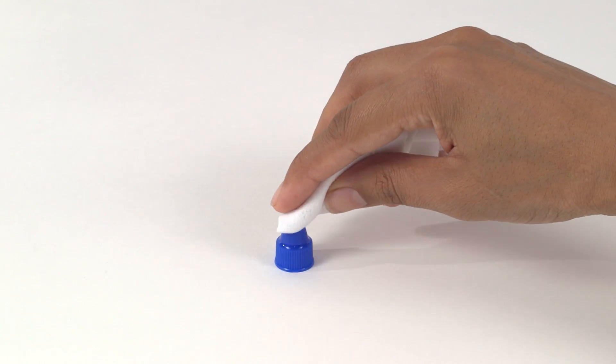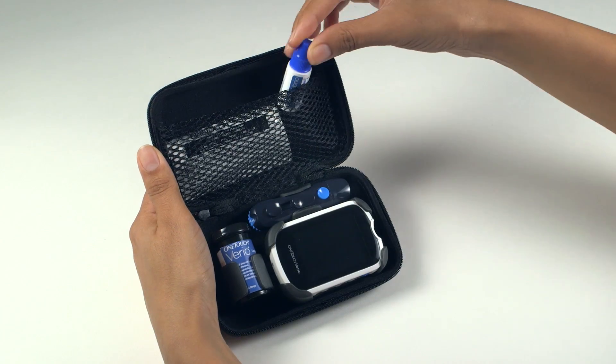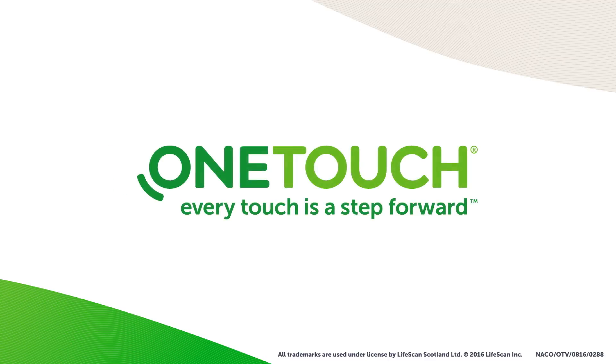When testing is complete, clean the top of the control solution cap with a clean, damp tissue or cloth. Remember to keep all of your kit together so you have everything you need exactly when you need it. If you want to know more, call 1-888-567-3003 for English or 1-888-567-3010 for Spanish customer services, or visit www.onetouch.com. OneTouch — every touch is a step forward.